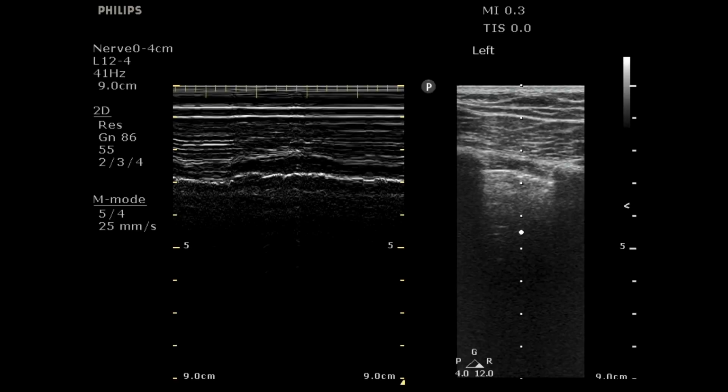And so as we go in, we'll look at the lungs, right? So here's the left side. We put an M-mode caliper between the rib spaces and look at the pleural line. We can see that sandy beach. It's a little dark, but you can see that there's a definite striation in the near field and definite granulation in the far field, suggesting that sandy beach or the normal lung sliding, right?